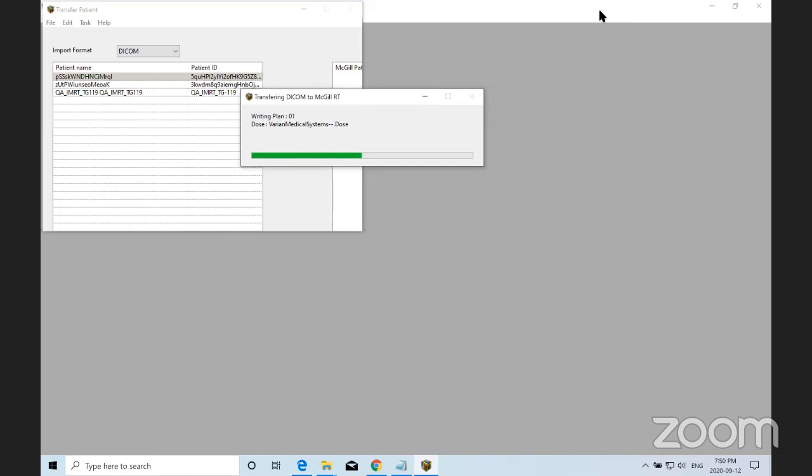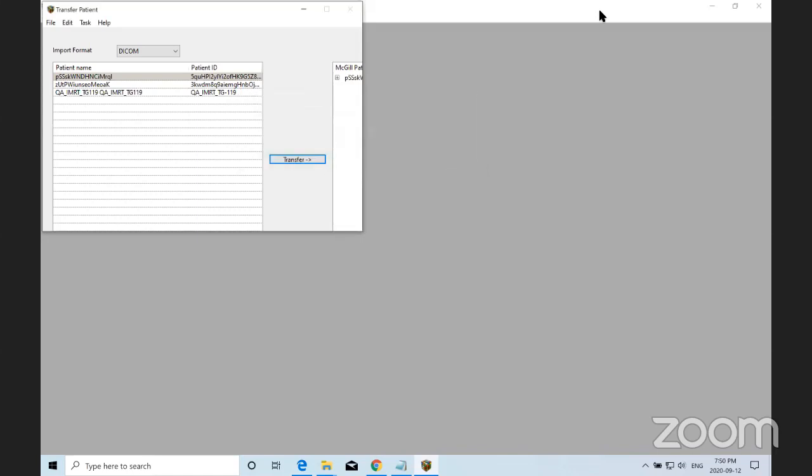So I'll answer that one. It really will depend on how many times that dollar sign will come up in other messages. Let's say the dollar sign is used in some of the output from an EGS calculation. It could be a beam calculation or a dose XYZ calculation. If that symbol appears in any of the output text, MMCTP will assume that the command has finished and will execute the next command in line.